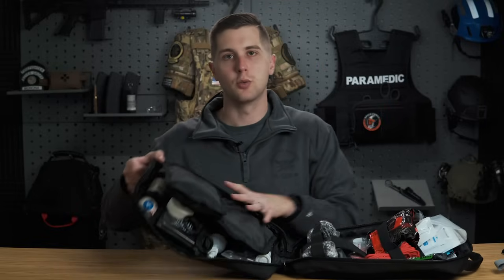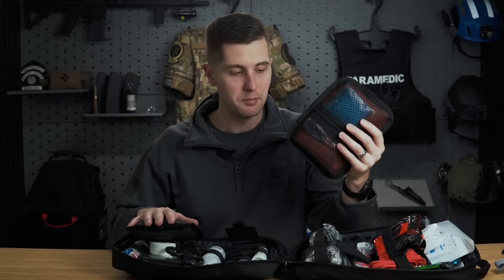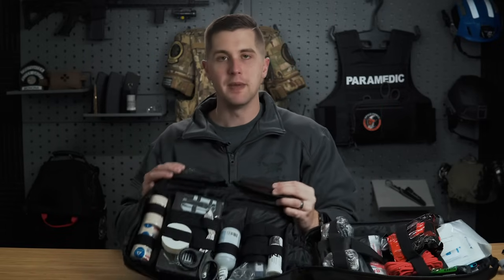Now going on to what I would call the lid of the IFAK, here we have even more things. So in this one, we have these two fold-out wings, and both of these are actually removable. So if you decide you don't want these in here, you want a simpler pack, you want to kind of rearrange it, it's great. You can take these out, or if you want to throw these to somebody, you can do that.